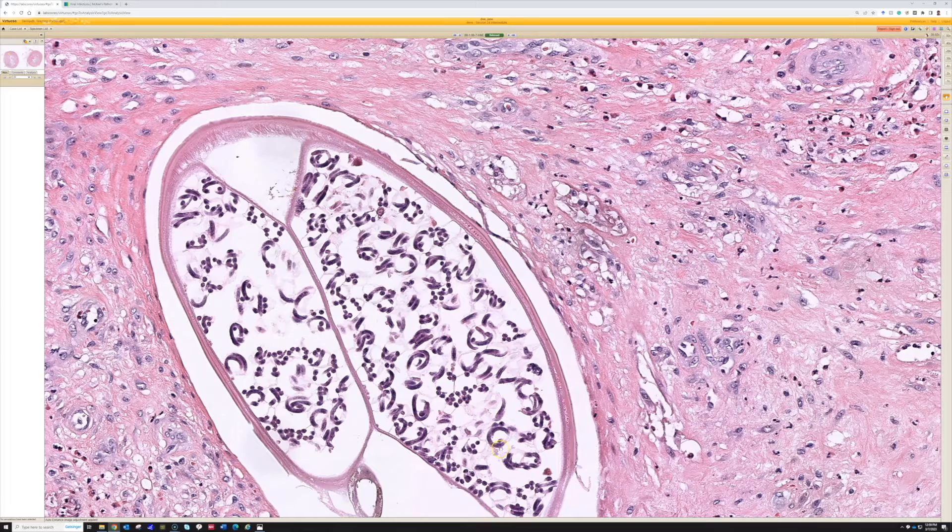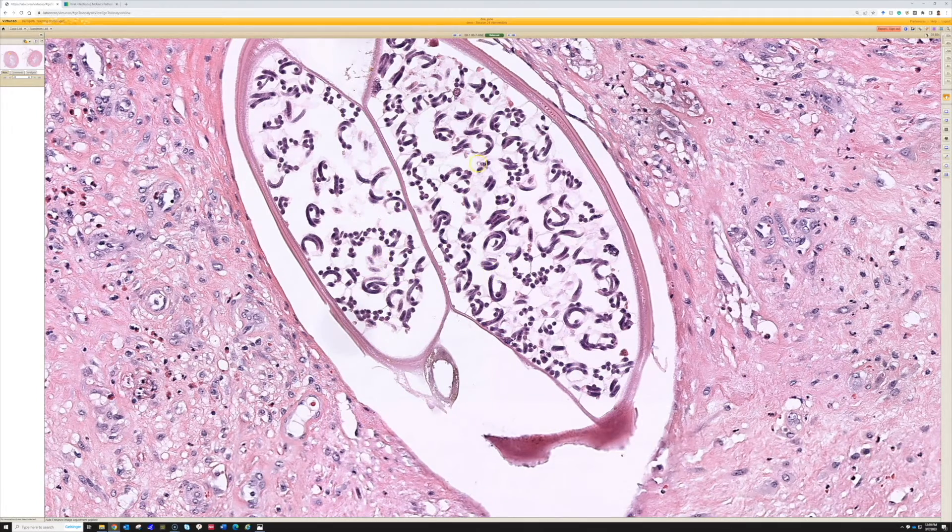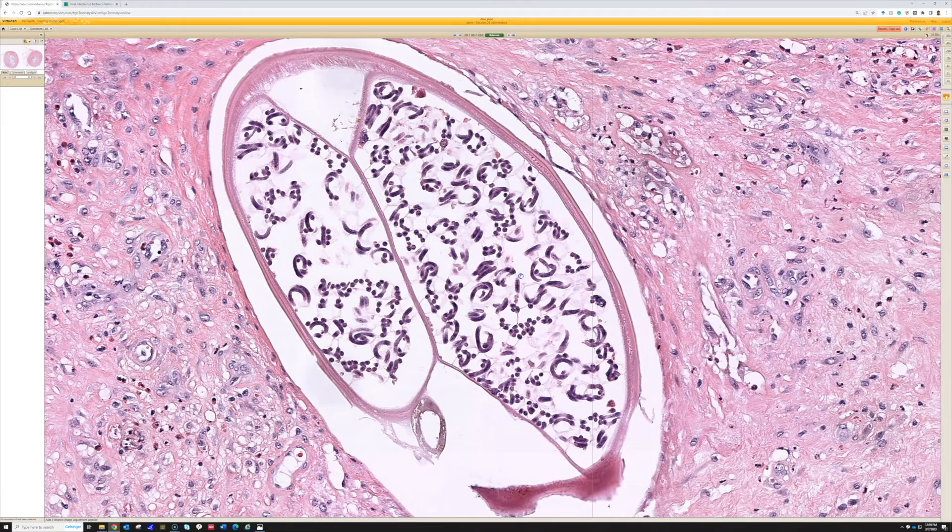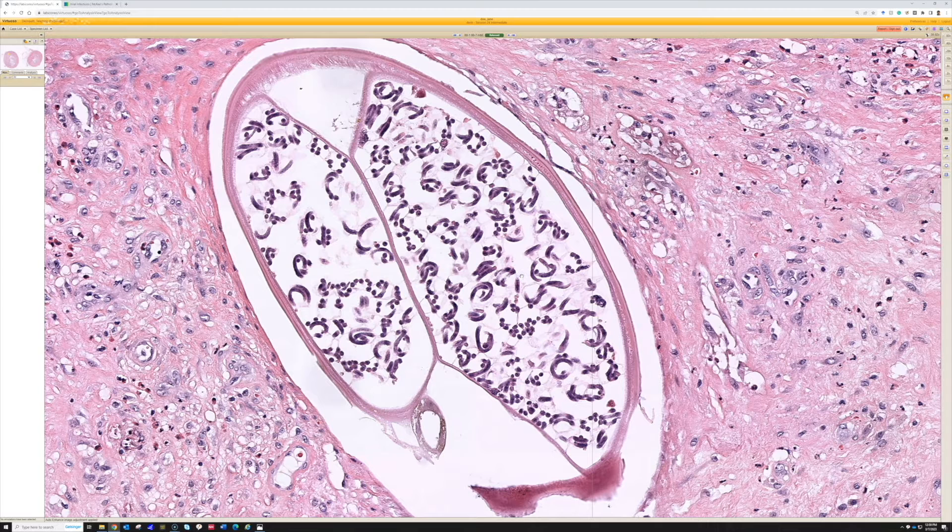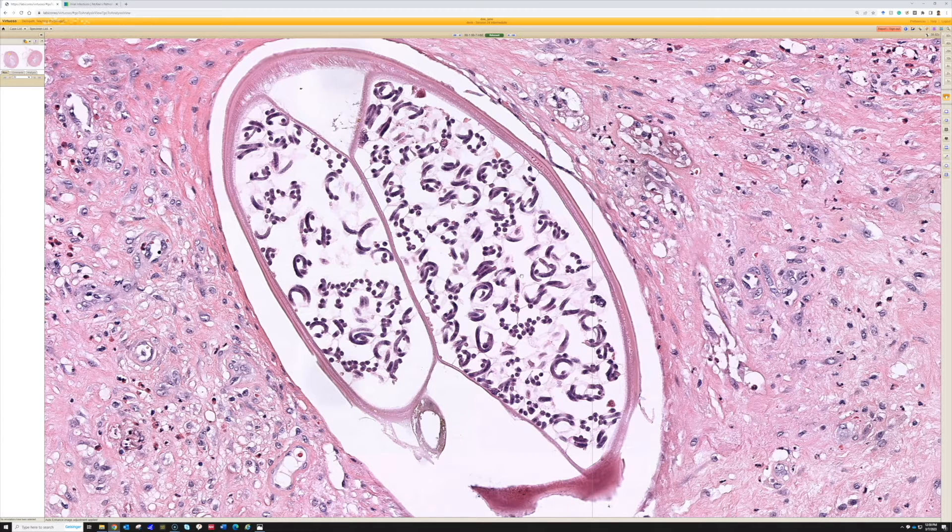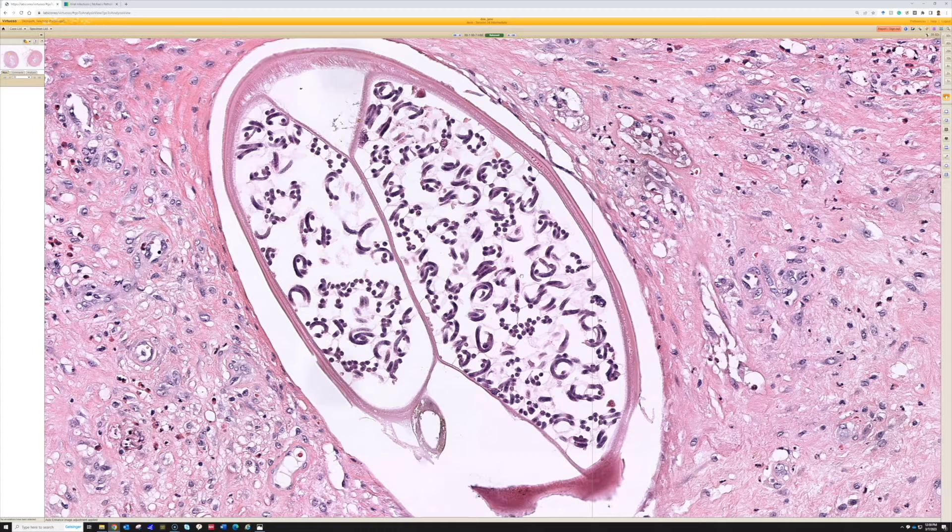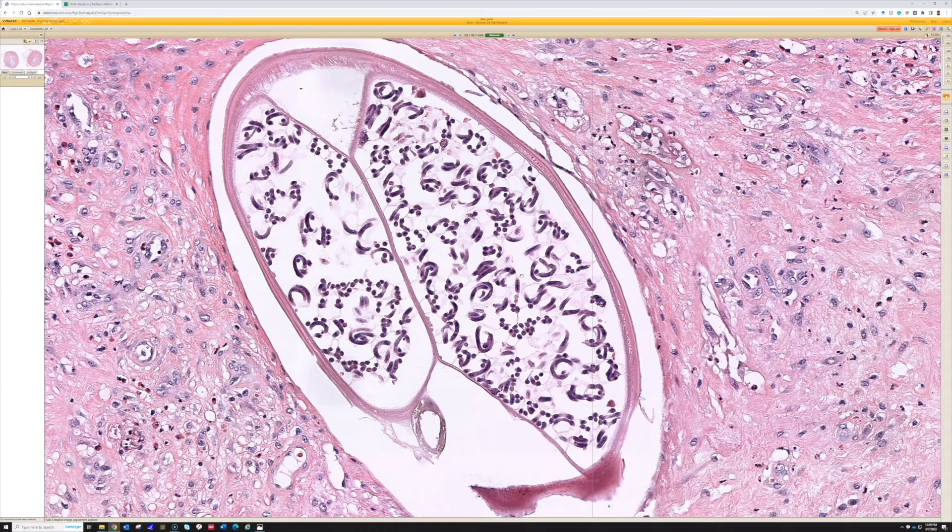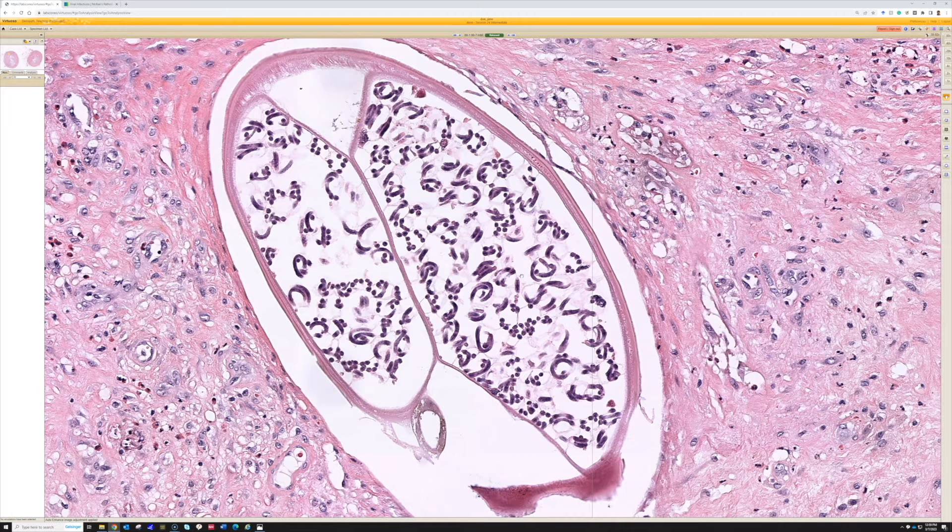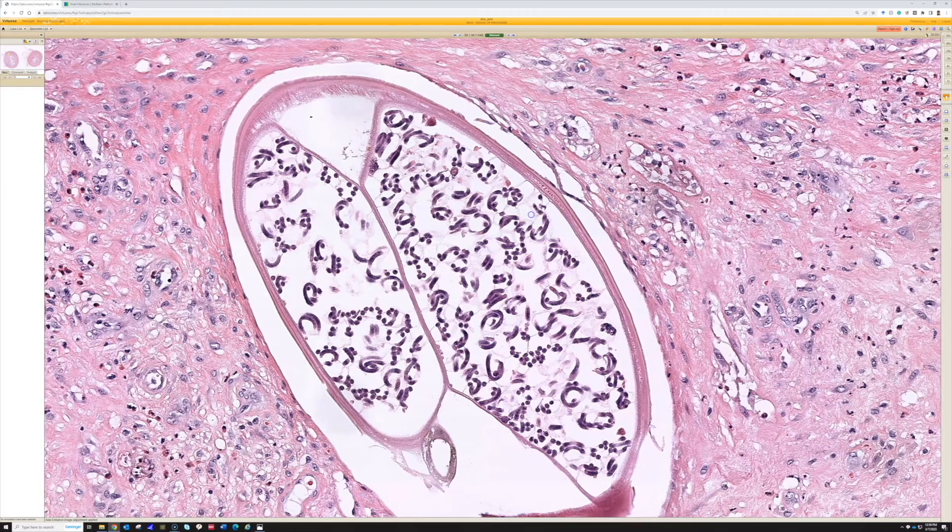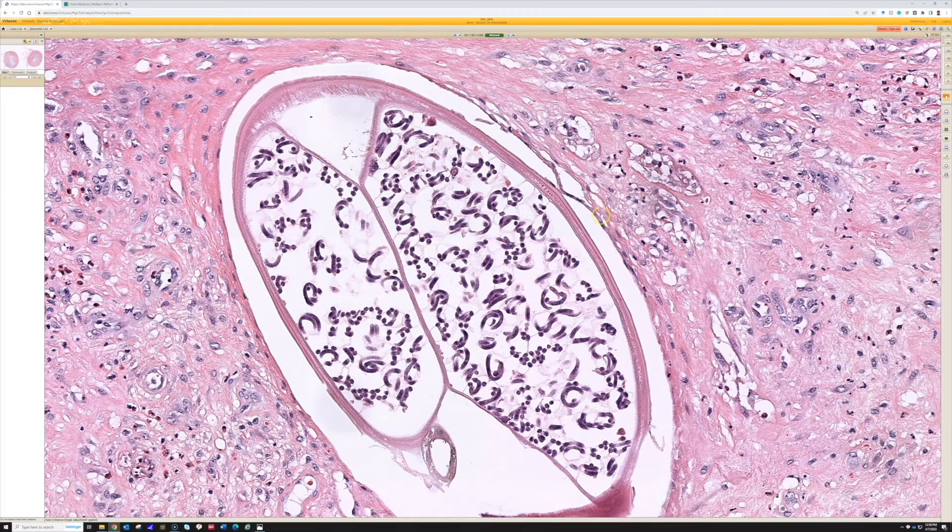So the adult worm makes this nodule. The microfilaria, though, cause much more, I think, of the morbidity and problems. And then those microfilaria are the ones that get taken up by the fly when the fly bites the host who has an infection with them. And those microfilaria then start the cycle all over again. So I'll put a link down below. There's a nice graphic on the CDC website that shows the life cycle of the Oncocerca worm.